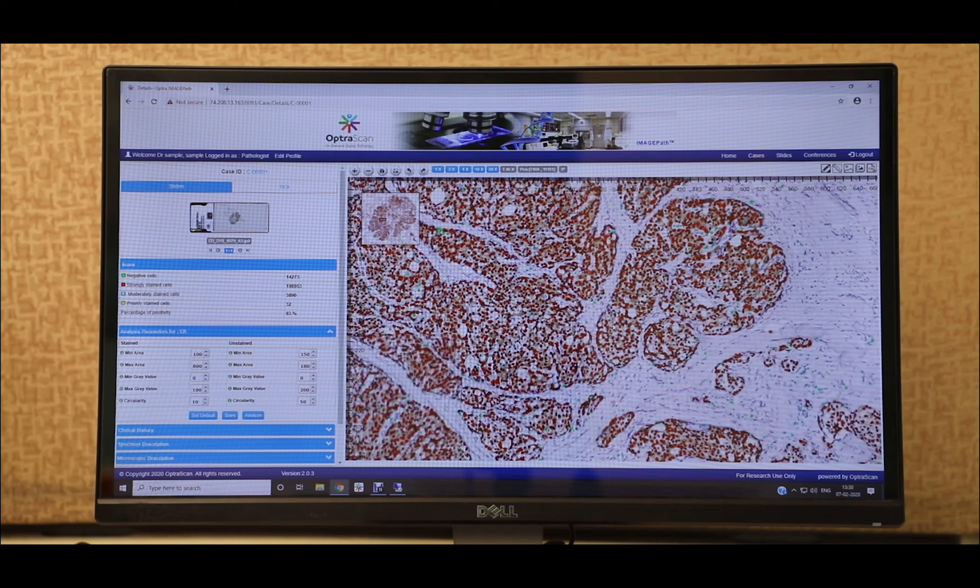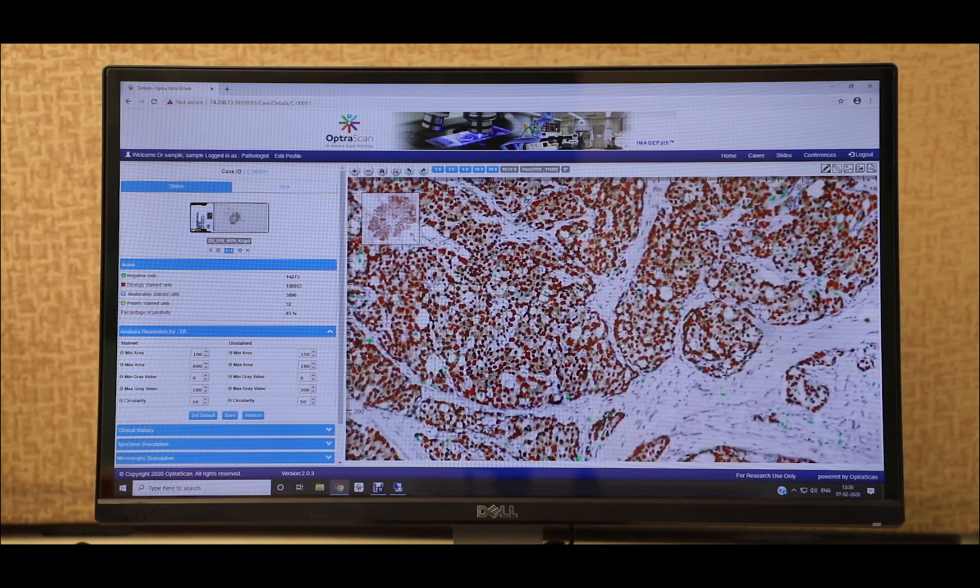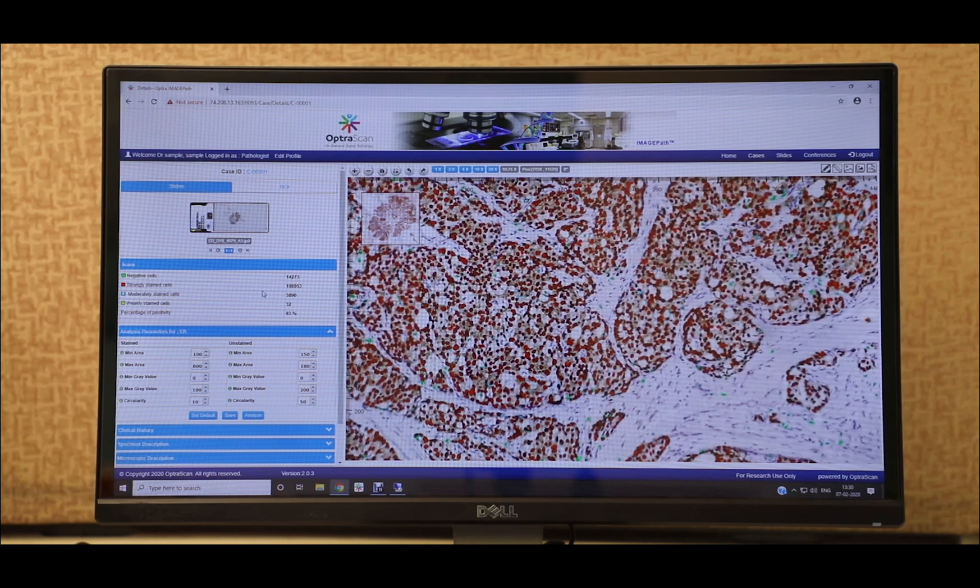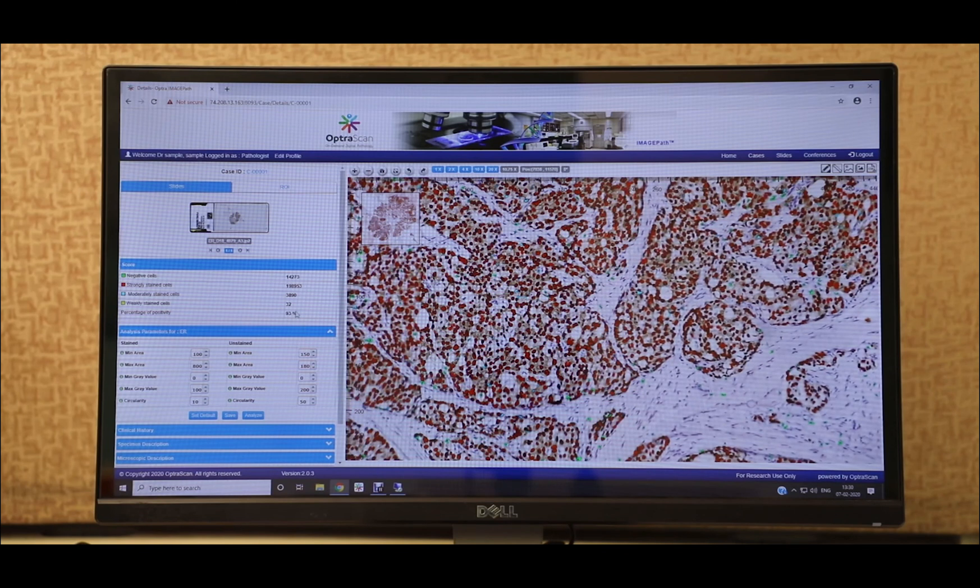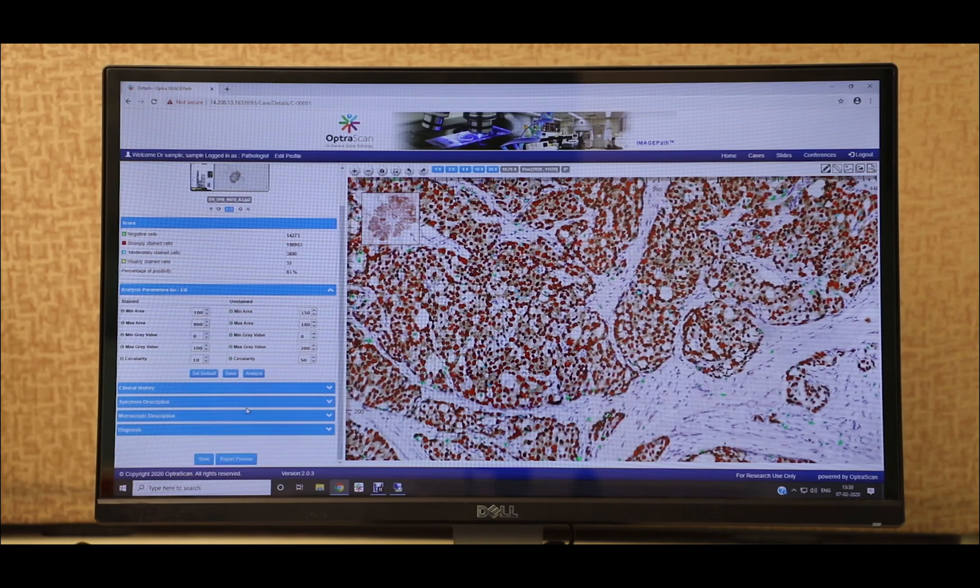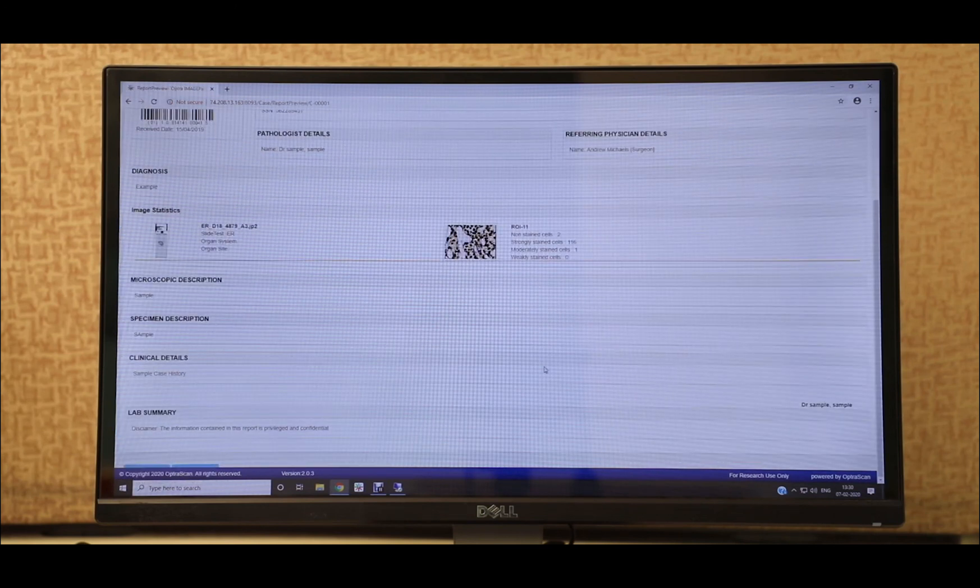The tissue components are digitally colored and the color legend along with the quantities are displayed on the reporting window under the scores tab. These scores can also be included in the final report as seen here.